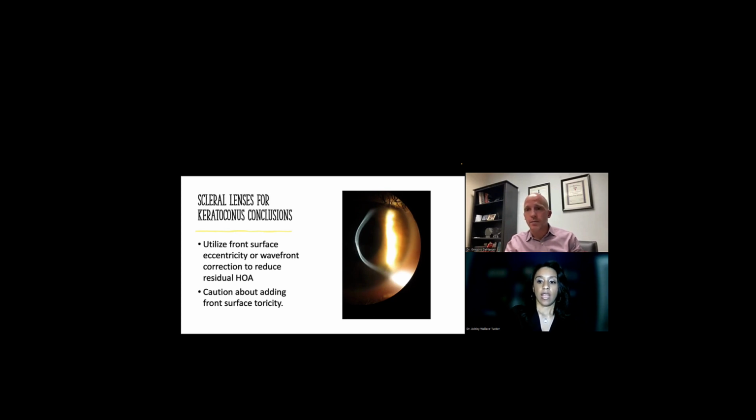Some of our viewers are asking, is the cost for wavefront corrected lenses significantly higher than just a regular scleral? Yeah, for the labs that are doing it, it is an add-on cost. It is significant. I won't go into pricing on a webinar like this, but it's significant.